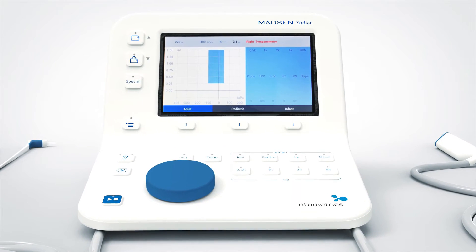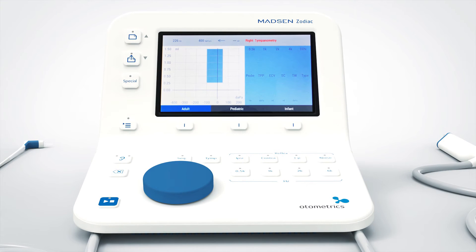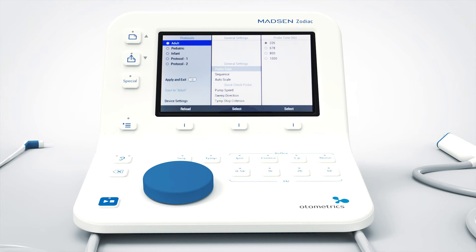To change a setting such as the pump speed, you need to go to the menu selection. Press this button to reach the menu selection. You may recognize the symbol — it is a commonly used symbol for manual settings in electronic devices. Press the button to reach the flat menu structure.